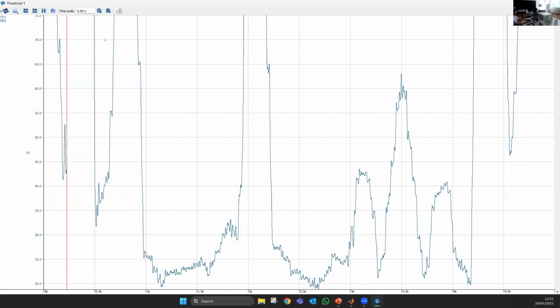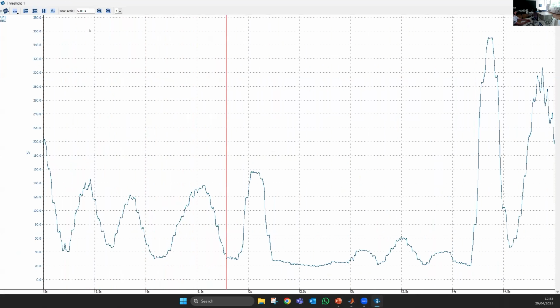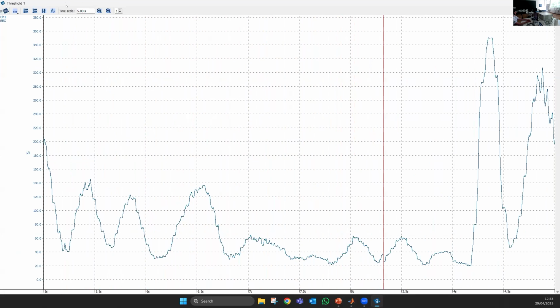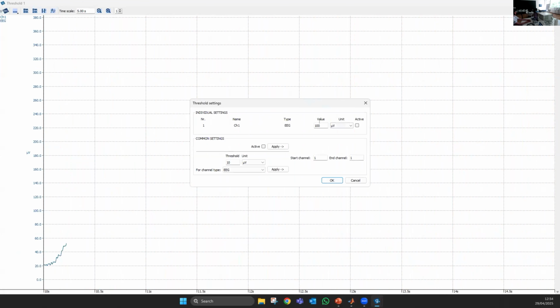So when he's getting relaxed, then the activity will go up. But first, let me set a threshold. So let's try around 100.